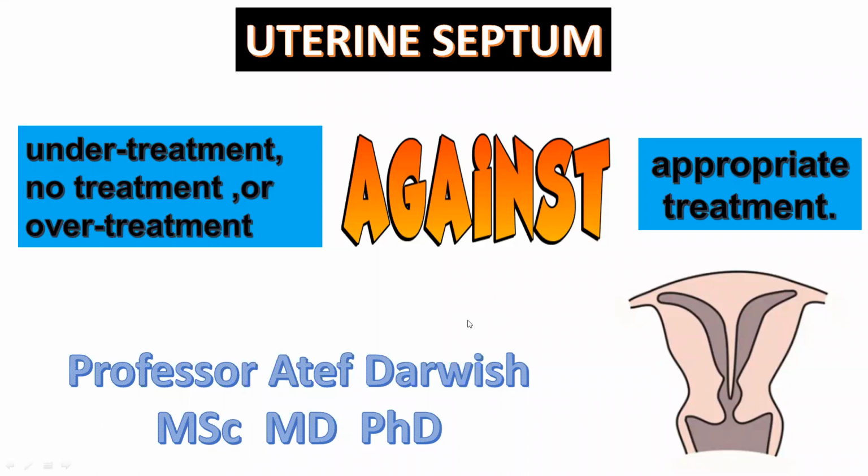Today, we'd like to discuss an important topic regarding hysteroscopic incision of uterine septum, which is commonly called hysteroscopic metroplasty. And we have to outline the clinical and practical tricks important to achieve appropriate treatment of the uterine septum by hysteroscopy.